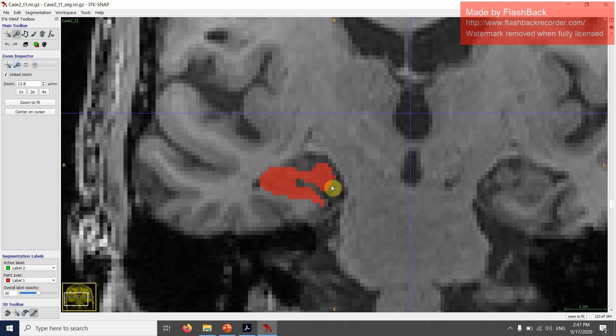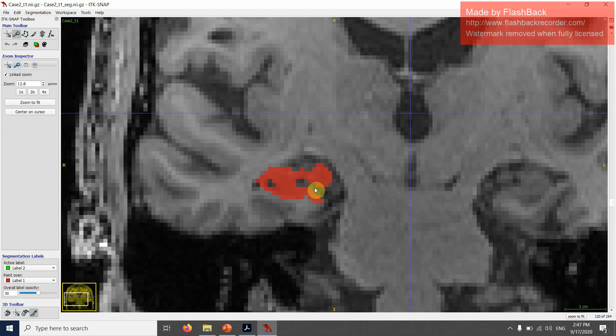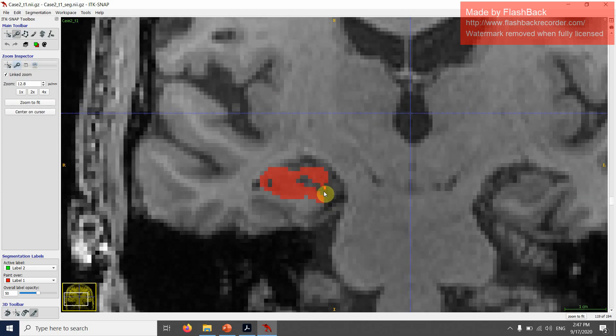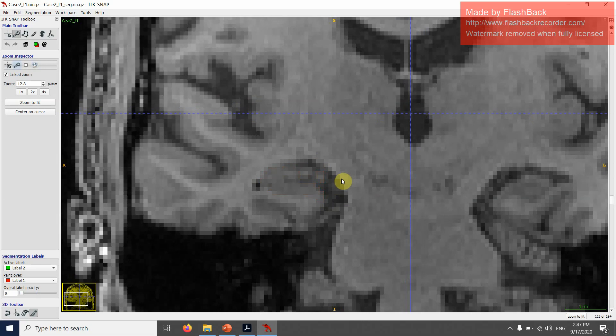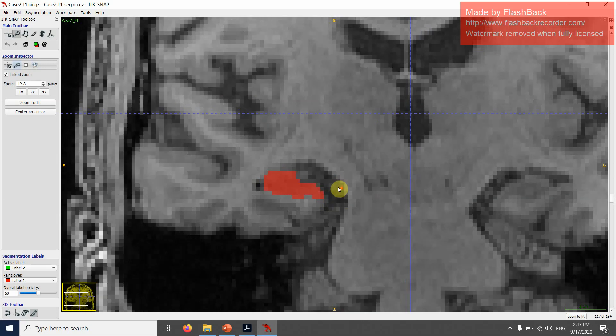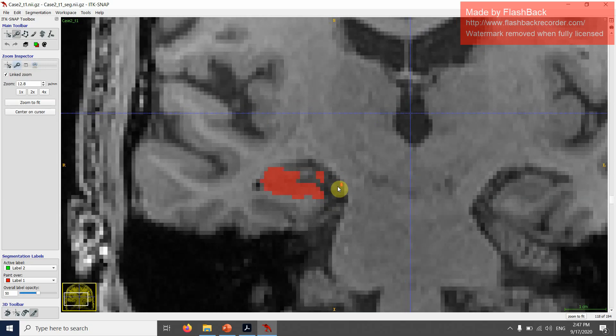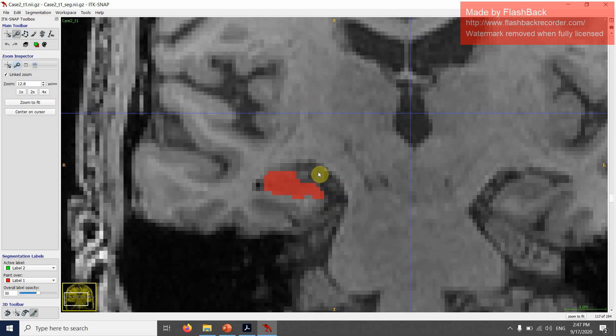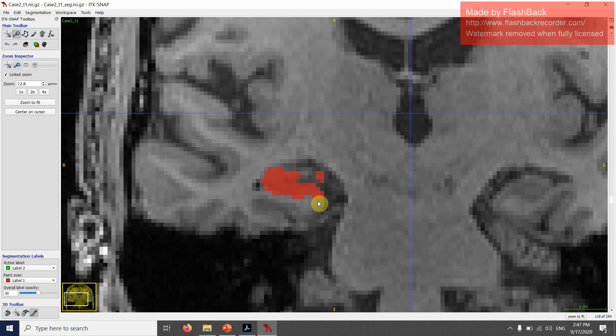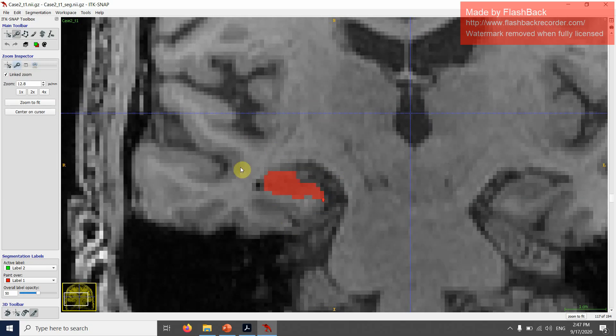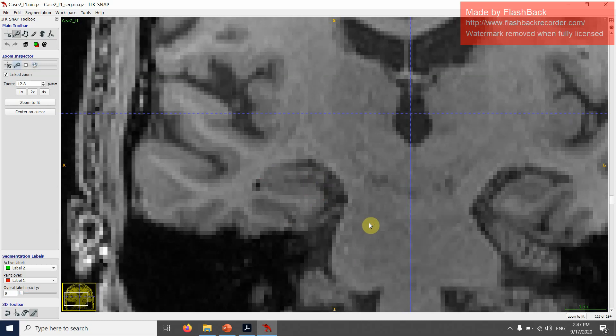I'm going to follow it in a posterior direction. You can see that it's becoming smaller and smaller and it separates out here and then it disappears. I think this would be my last slice of the anterior hippocampus and this would be the first slice of the posterior hippocampus.